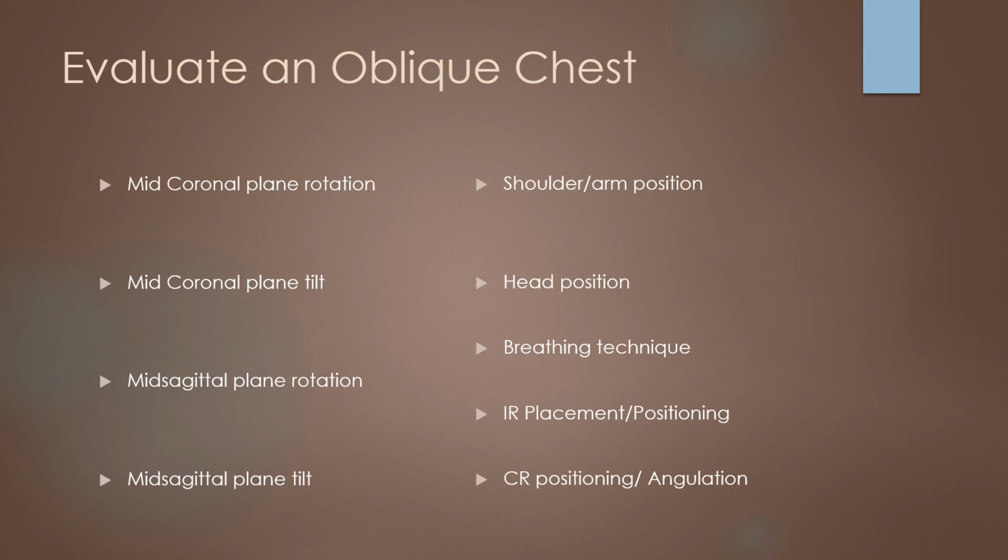Okay, so I'm going to let you read through this, and I want you to start developing your thoughts as to what an oblique chest is going to demonstrate for you.